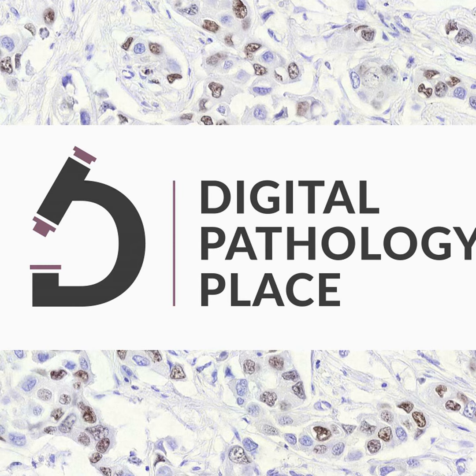2020 also saw significant regulatory flexibility in response to the COVID-19 pandemic. In March, the Centers for Medicare and Medicaid Services, CMS, issued a memorandum temporarily allowing pathologists to review pathology slides remotely from non-CLIA certified locations during the pandemic, subject to certain conditions.